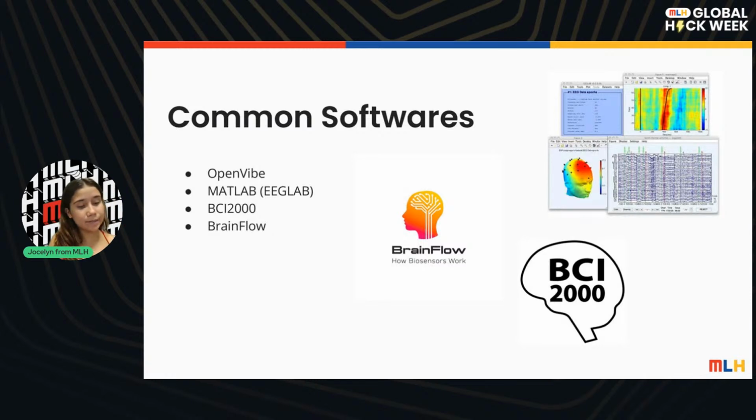And every headset that you basically use has its own SDK that you can use in order to start building stuff. So, for example, the Neurosity has its own SDK, but there's also other headsets that have their own software, so you can start viewing all of the things that are in there in order to test them out.